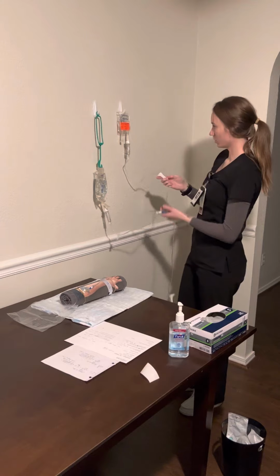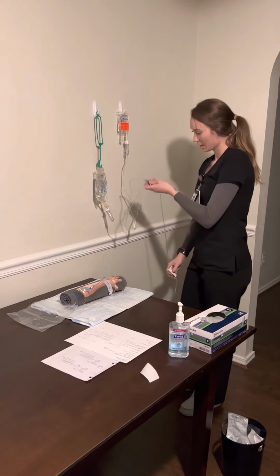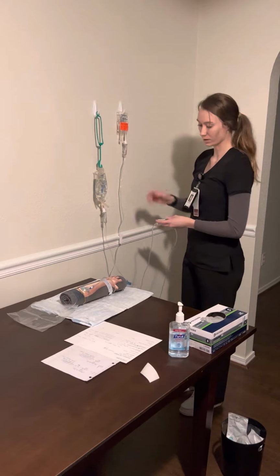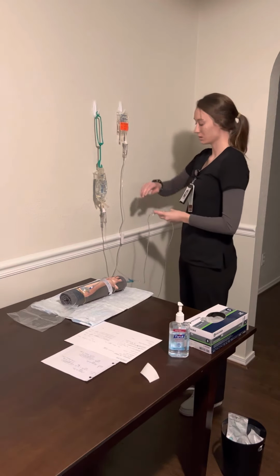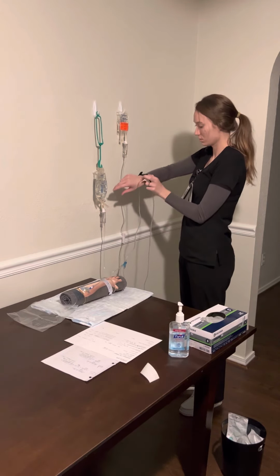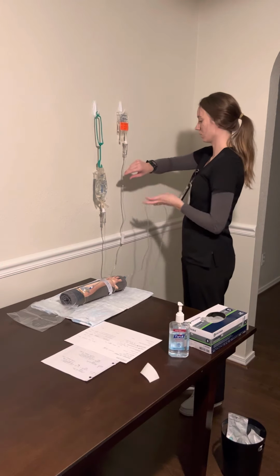We're going to open the cefazolin, okay, and then we're going to count our drip factor from the roller clamp on the primary tubing. So we are looking for 25 drops per minute. So all right, we're going to start that now.